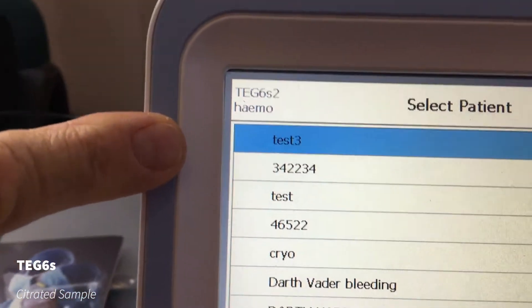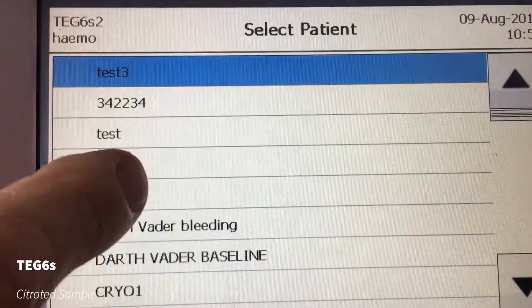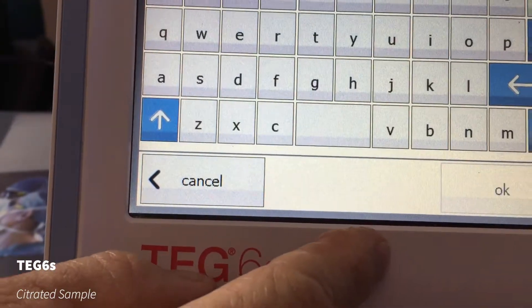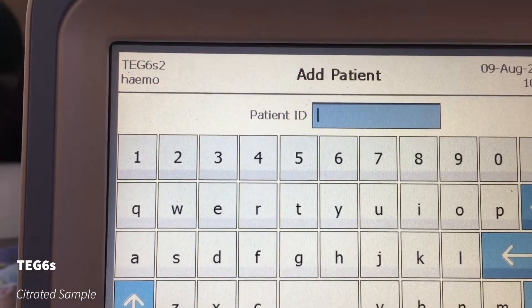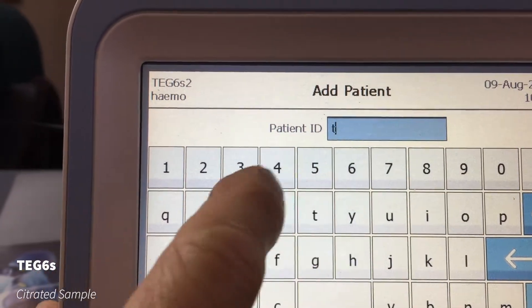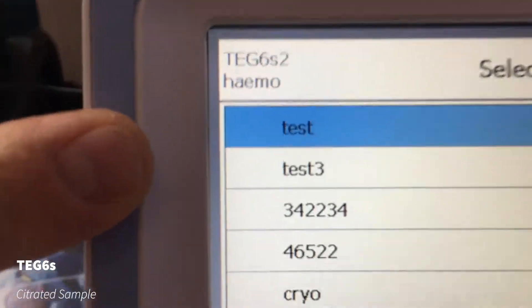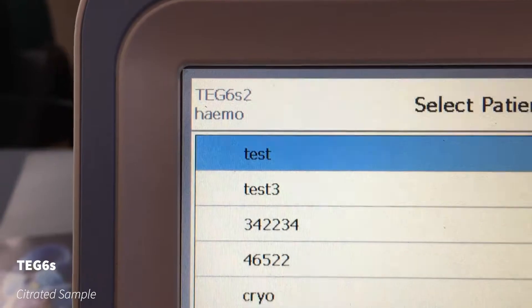The blue is highlighting which person or patient you're going to be testing. If you've already tested them, you could just highlight that and then go next. But in this case we're adding a new patient, so we go plus, and this is where you would put in that UR number. You can either barcode scan that. So if I just put in 'test' and then go okay, you can see it's come up asking: is this the right patient you want to test? So you just go next.